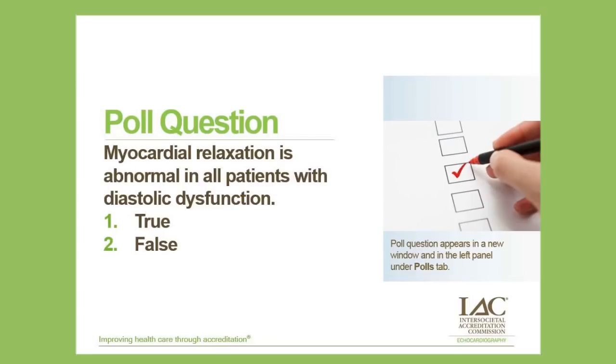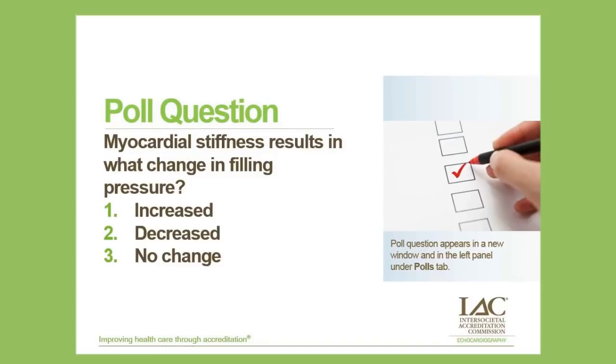Let's remember those numbers. I have one more question for you. Myocardial stiffness results in what change in filling pressure? Does filling pressure increase, decrease, or is there no change in filling pressure with increased myocardial stiffness?